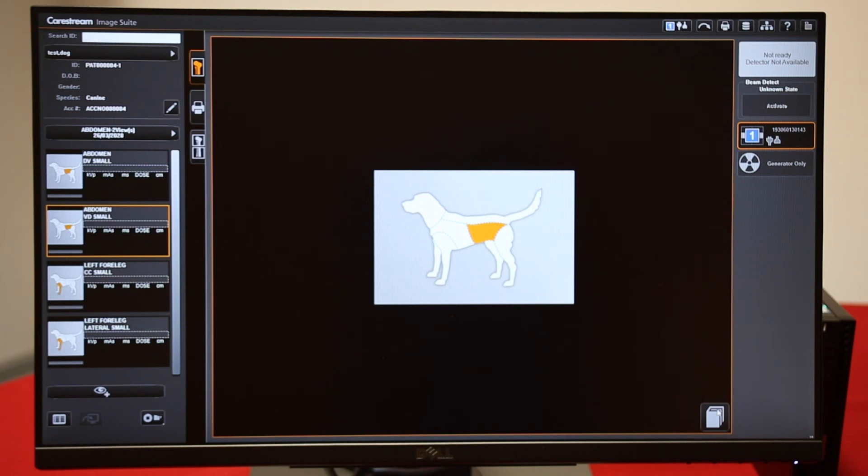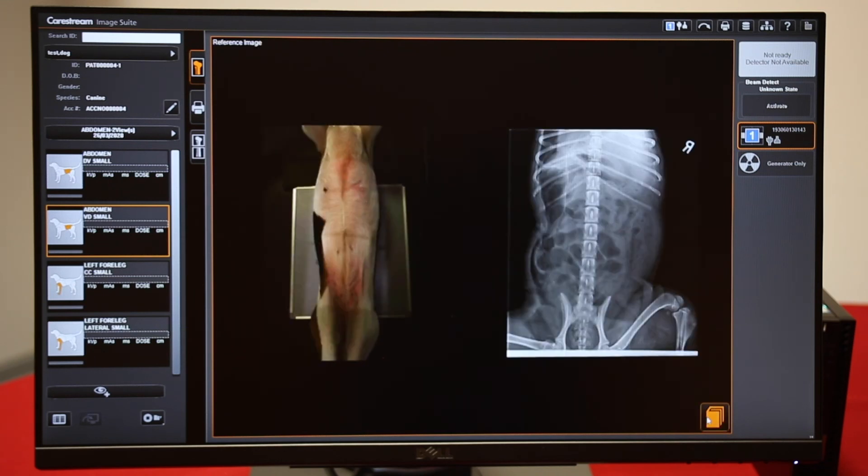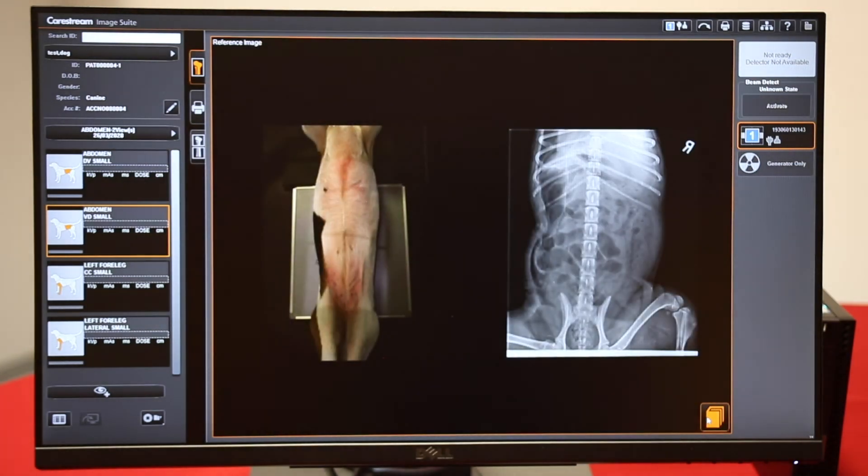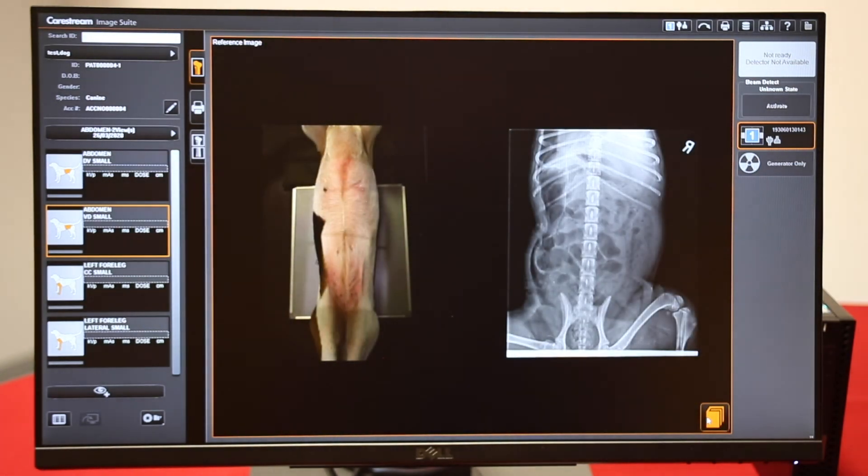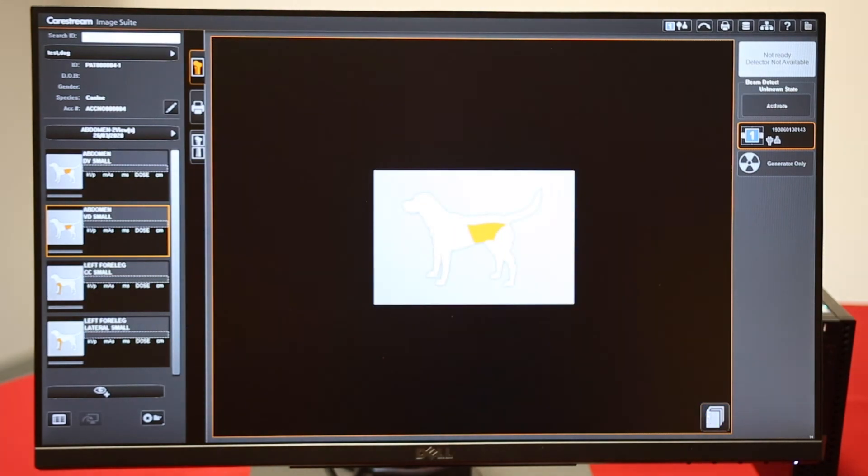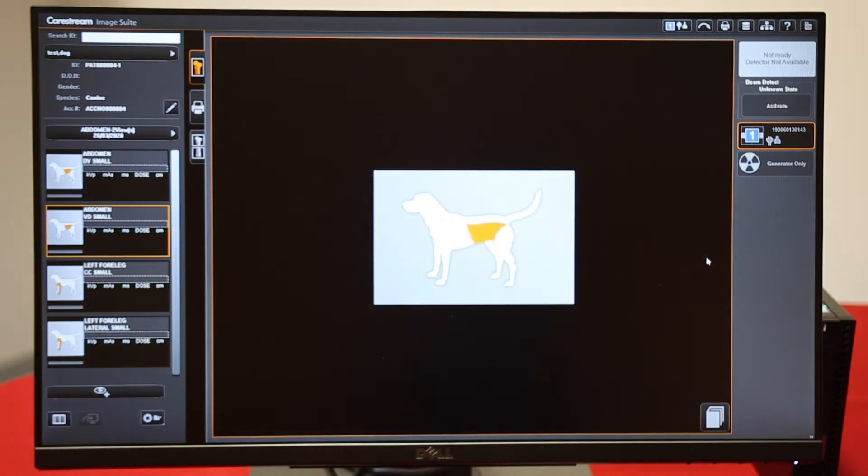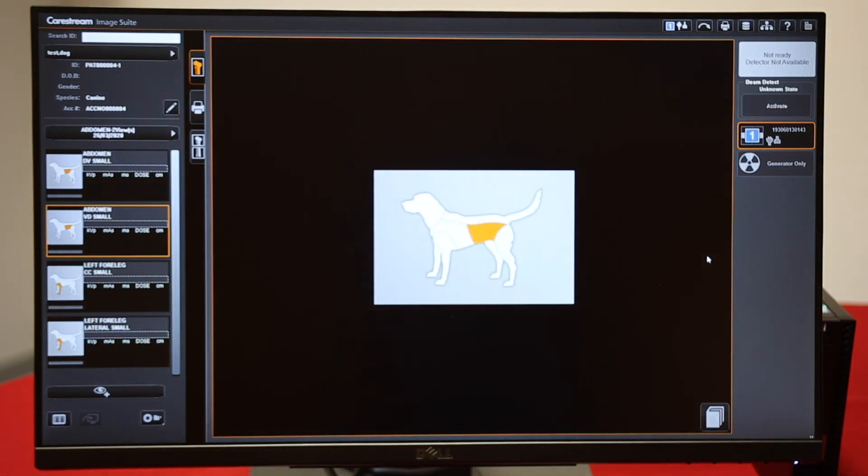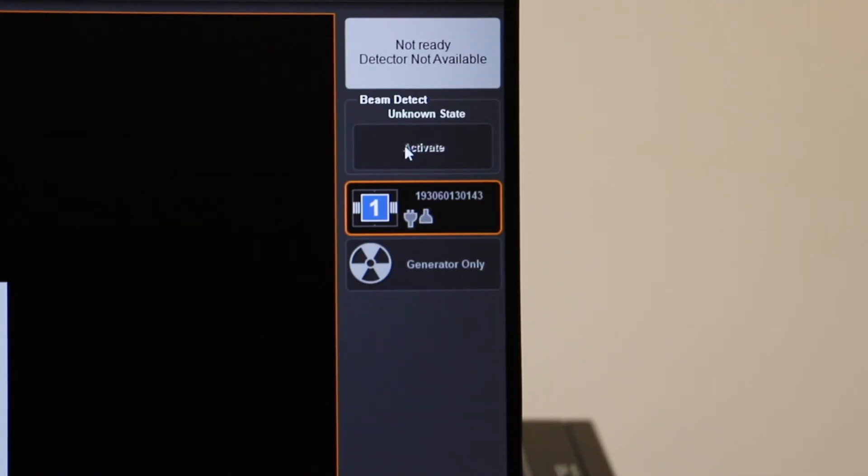Down on the bottom right here, you can check for a positioning guide and a sample x-ray. If you're using the DRX system, click this to activate the plate before you take the x-ray.